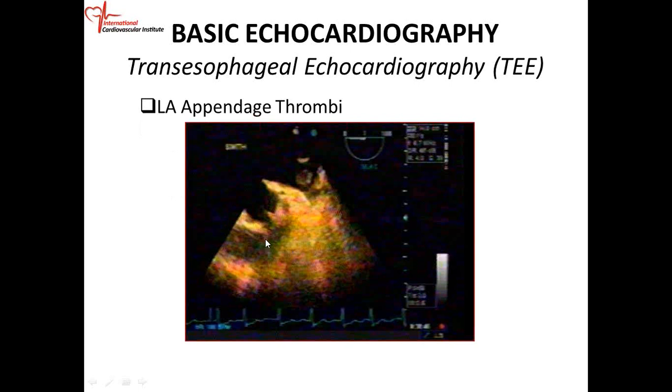All right. So when we talk about left atrial appendage thrombi, whenever you see a semicircle along with a study, it's probably transesophageal echo, and you can move from 0 degrees to 180 degrees. Okay. And then this is the left atrial appendage. Left atrial appendage is right here. You can see this nice circumscribed thrombus.